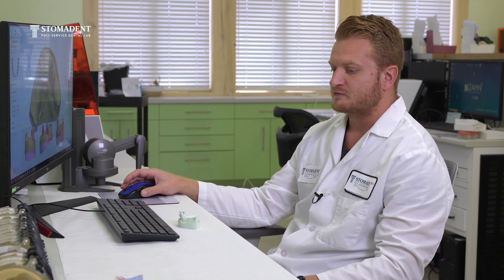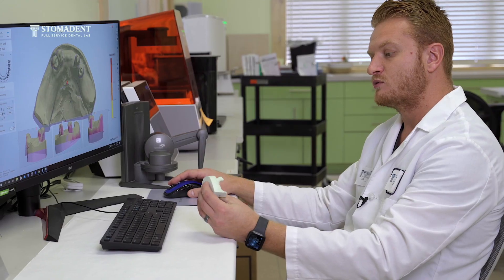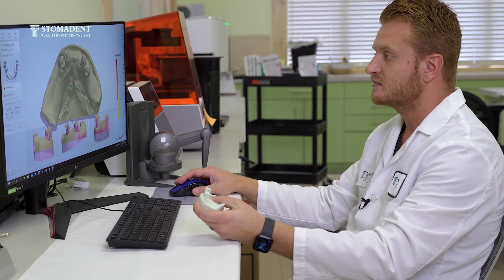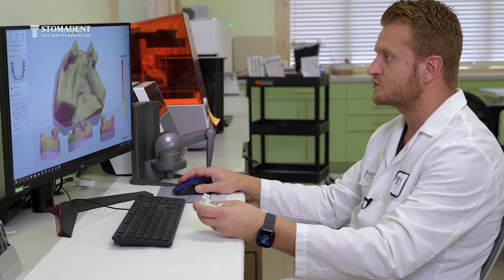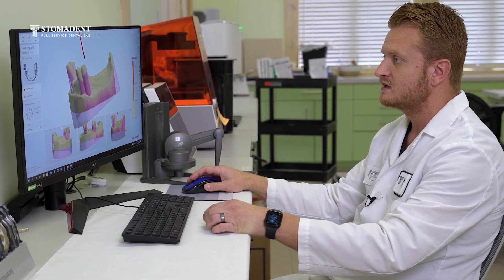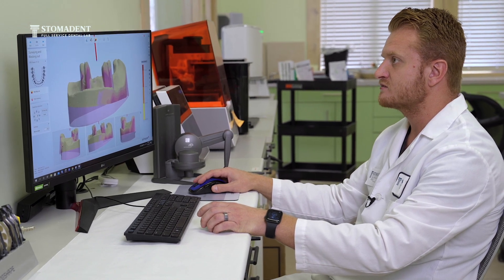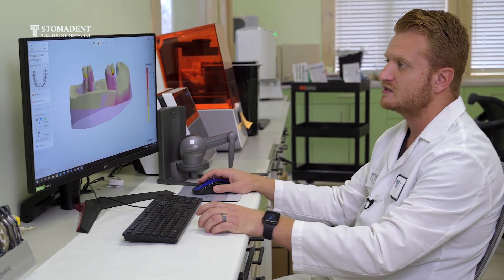For instance, in this case as we're designing a wyronium metal frame, we first choose how we want to survey our case, and as we set up the correct path of insertion, we end up opening the undercuts.